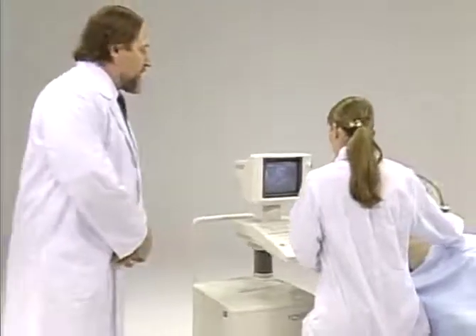Even if the various scanning procedures we have discussed so far are followed strictly, correct evaluation cannot be done unless clear images are obtained. Then, what are the conditions required for good images?